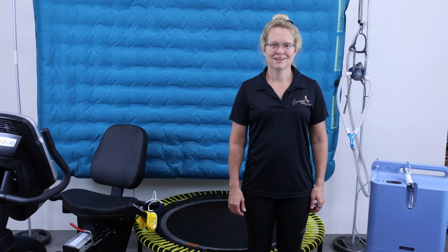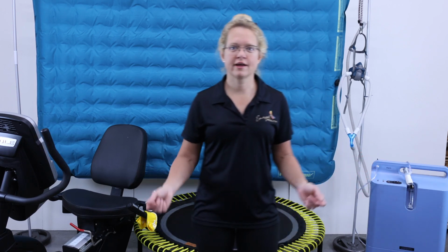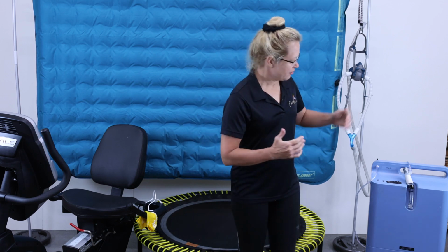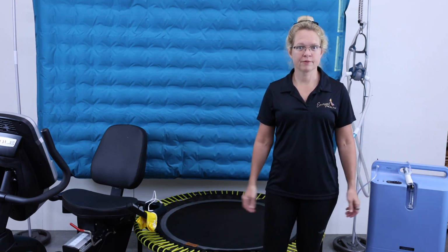Hello everyone. This is my EWOT system, my exercise with oxygen therapy system, and this is my personal one that I built and set up in my home to use for myself and my family. And it's super simple to build one of these for yourself and use at home.